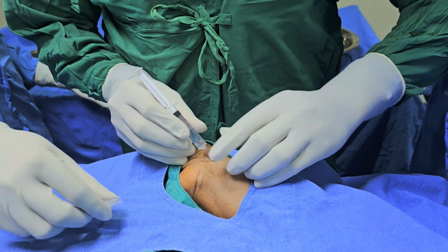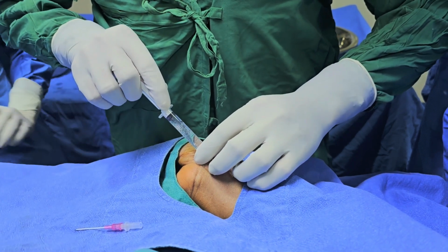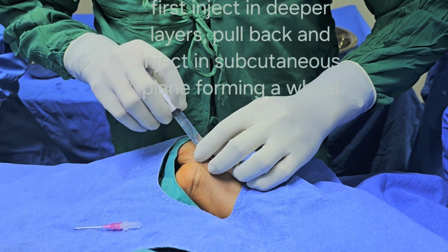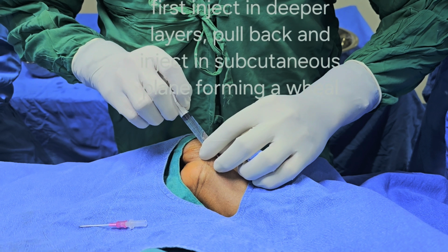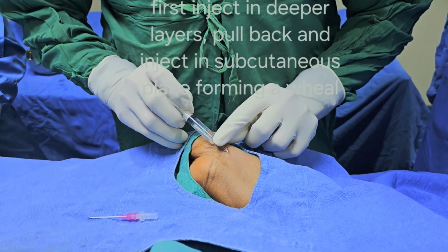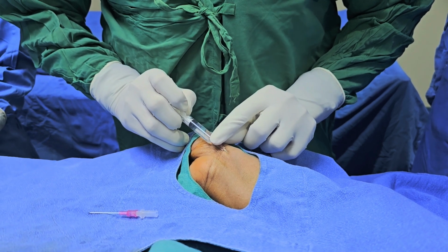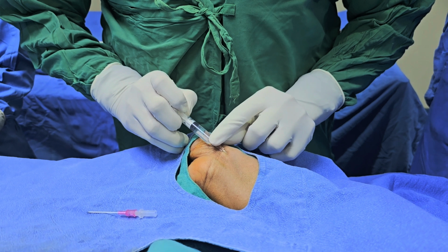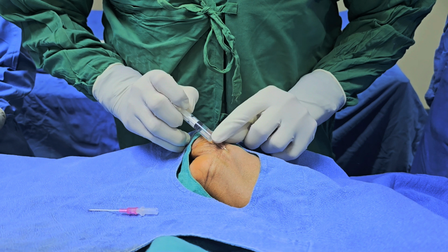Initially in the deeper layers, then pull back the syringe and inject the local anesthetic superficially under the skin just above the radial artery. It is important to form a wheal above the puncture site so that the patient is comfortable during further procedure.